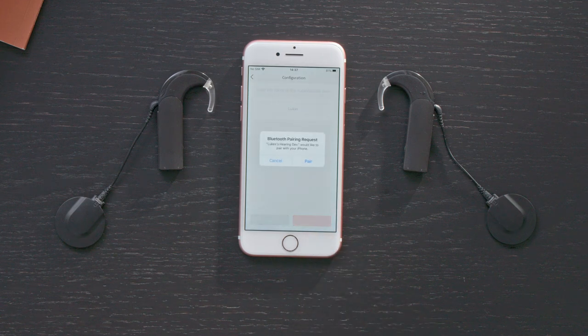A Bluetooth pairing request screen will appear. Tap Pair. Repeat this for your second AudioStream, if you have one.